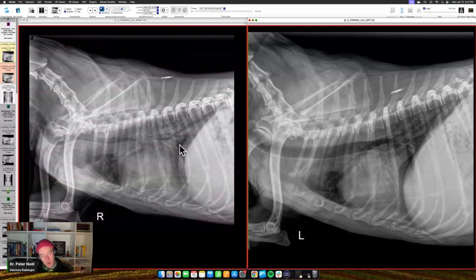Well, when you've smashed the airways shut and you've blown out a ton of the gas, you're already in trouble. So you're losing the blackness. Everything's going to look more white. So it's going to freak you out that you got edema. So in these respiratory cases where you need to decide, is this a non-cardiogenic, dog's got collapse, we got chondromalacia. Okay, check. That's a chronic thing and maybe it's worsened acutely and we need to give them some acepromazine or TORB or fluids or, you know, put them in oxygen or relax or whatever.